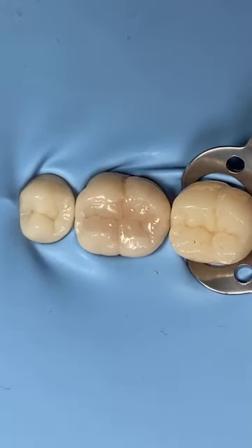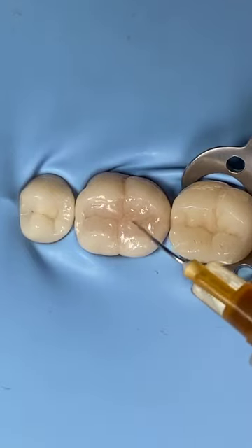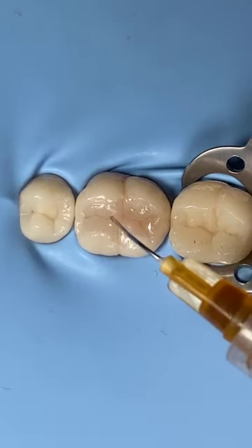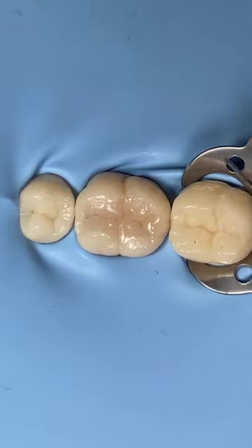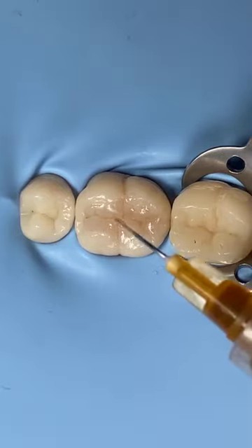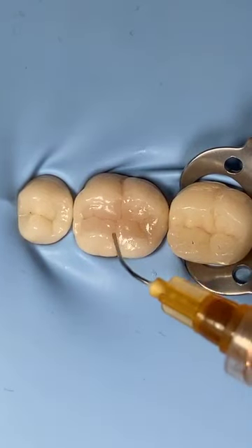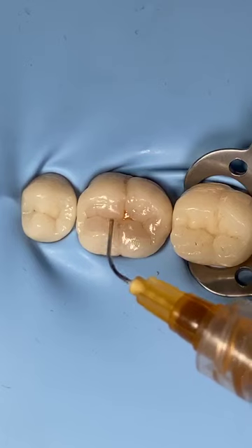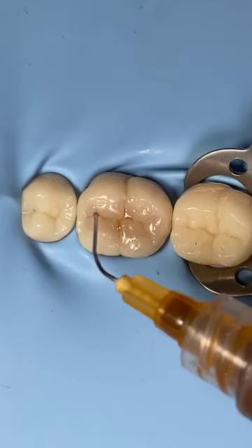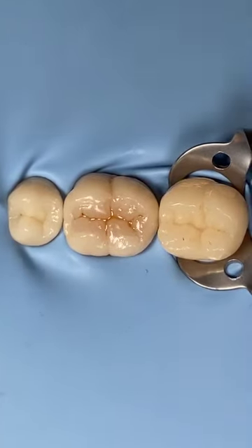I would like to say low viscosity because if you put it on the surface of the tooth, it will easily self-level and go underneath without you spreading it out. Yeah, let's see. Don't worry, just put a lot of it. Don't worry. Okay.